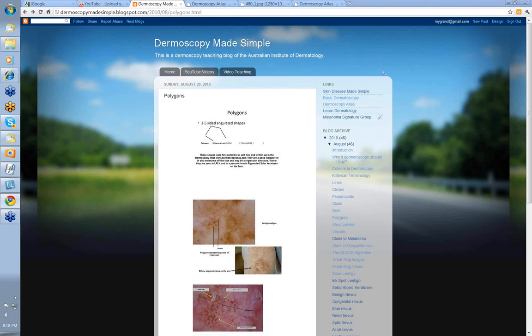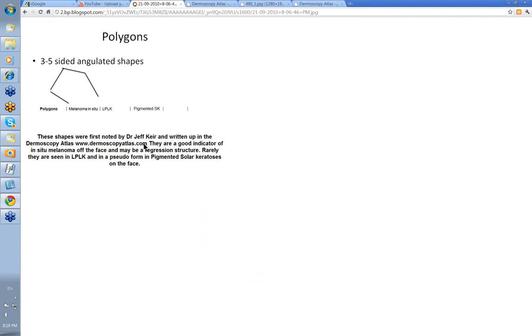Hello, my name is Ian McCall and this is a Dermoscopy Made Simple video on polygons. What are polygons? Well, they were shapes first noted by Dr. Jeff Keir in dermoscopy and they were written up in the Dermoscopy Atlas in about August 2010.